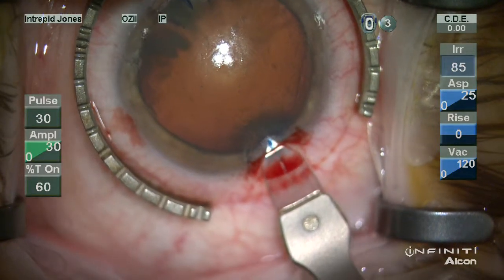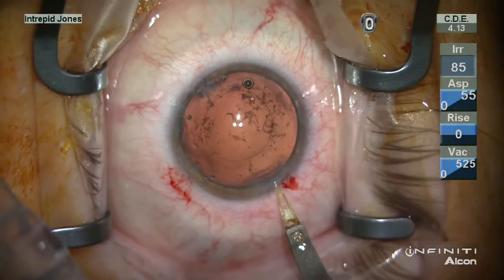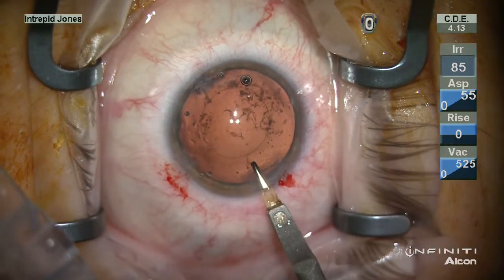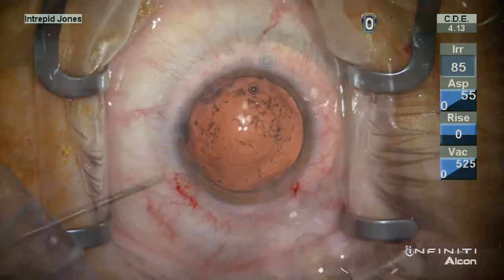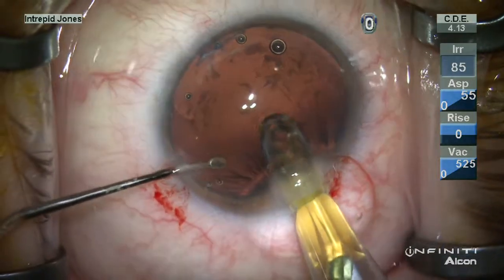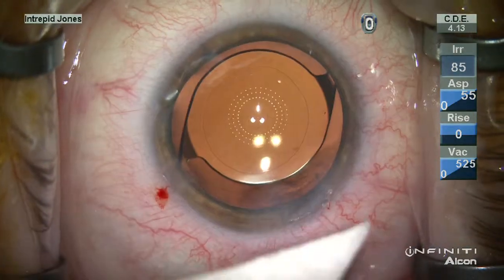The posterior edge of the wound is depressed and the main wound is made centrally in this LRI. Now, in placing the IOL, I find it helpful to slightly enlarge this wound. I use a 2.2 millimeter internal wound, and I find that it's easier just to enlarge this just slightly so that there's less tension on the incision as the lens is placed, and these seal incredibly well.